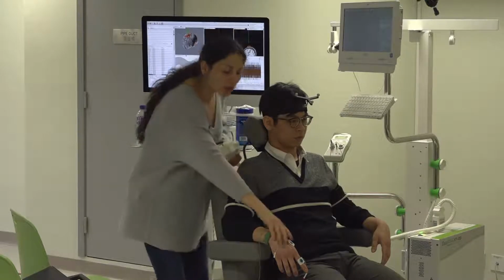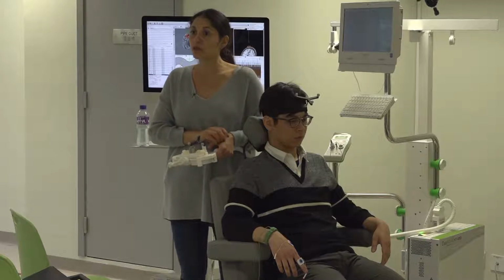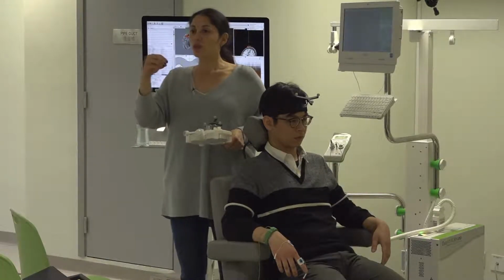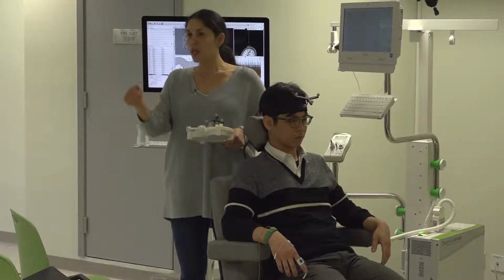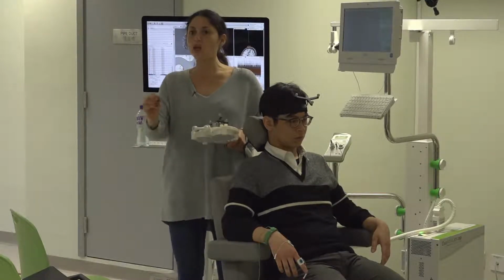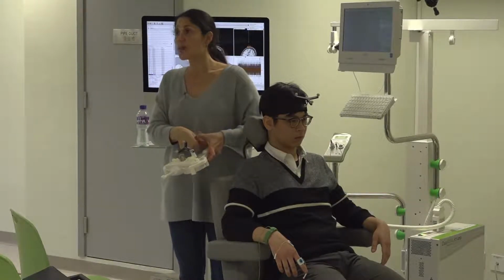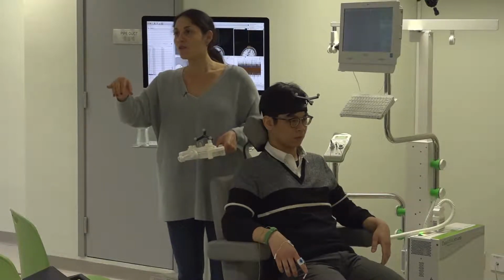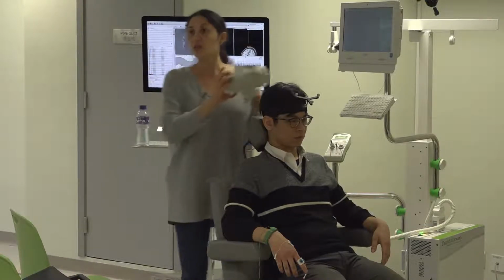I don't see this very well attached, so I will use some tape so that I have a better contact with the skin, which is very important. Sometimes you cannot get the motor potential without moving more fingers, and it's the only way you will get it. Some people have a clear, clean twitch, and that's the point. But take into consideration that the electrodes are located on the muscle. So I'm getting the signal from that muscle, and although another finger moves, anyway I'm getting the signal from that muscle and it's telling me, okay, you're stimulating there, right?